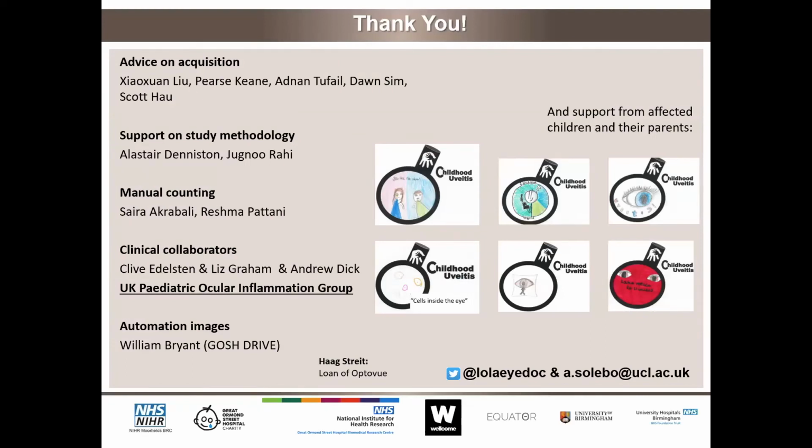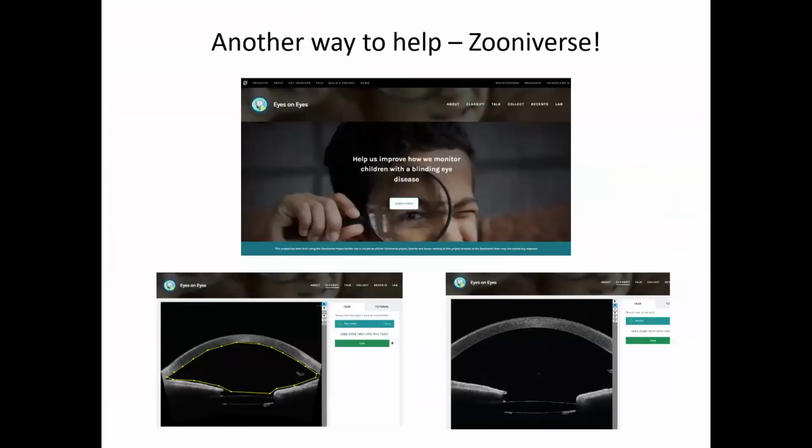Please feel free. So we had one question on intermediate uveitis, on whether or not imaging was helping there, and it really is. There's a team in Birmingham that are working on OCT at the back of the eye and using that to grade how severe intermediate uveitis is. They're about 2 years ahead of us, so their findings are going to start being used in practice over the next few years.